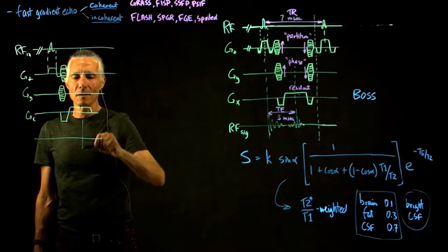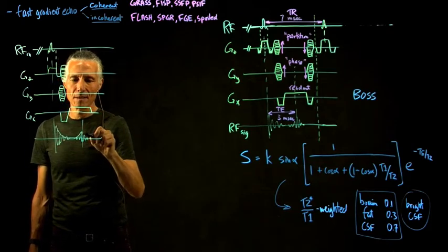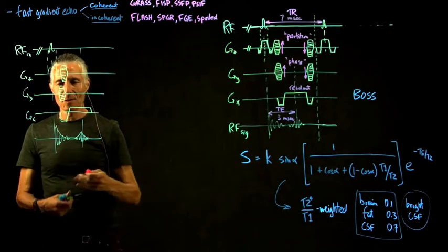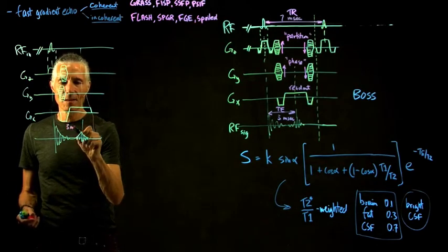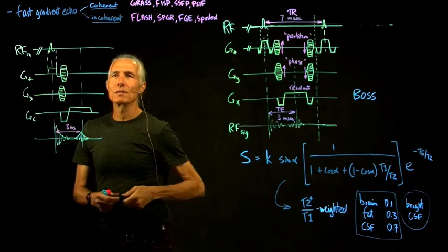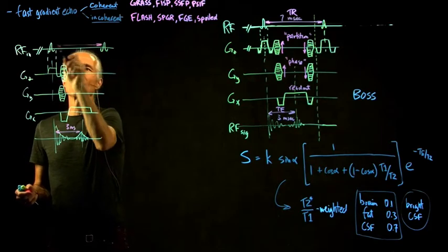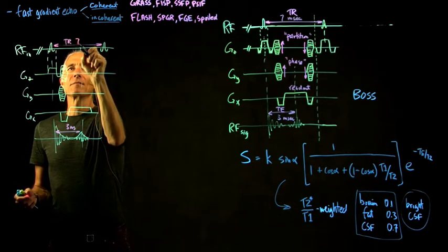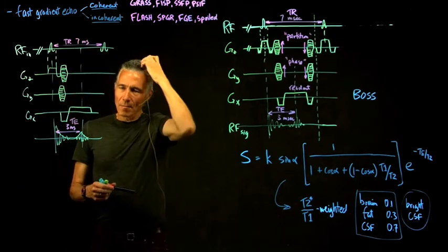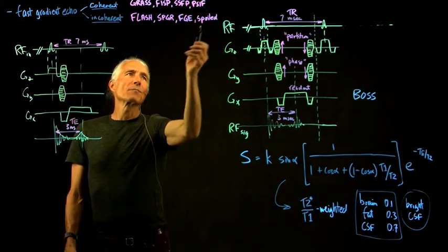So that's all the same. And there's a gradient echo here. And that gradient echo is T2-star weighted. But now, again, we're talking a very short time, like 3 milliseconds. And the time to the next pulse is, again, very short, maybe 7 milliseconds for the TR. So this is the TR, 7 milliseconds. This is the TE. And so now we're ready to go again. But the problem is we've got a lot of leftover magnetization. And so that's why we spoil it.